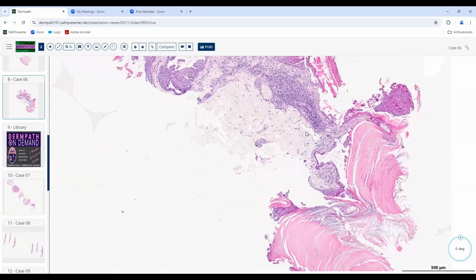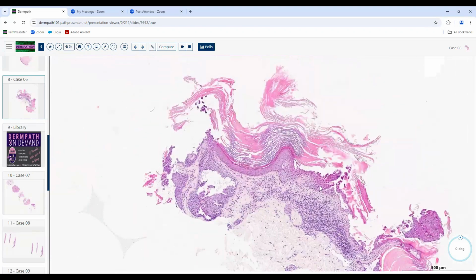And when we see something like this, we think it's probably some kind of hamartomatous process. Whenever you get these broad zones of parakeratosis with normal zones of keratosis between them, you should think about things like maybe an inflammatory linear verrucous epidermal nevus, some type of epidermal nevus, some kind of a nevoid or hamartomatous type process. This clearly isn't psoriasis.